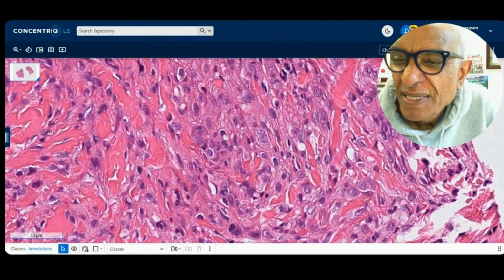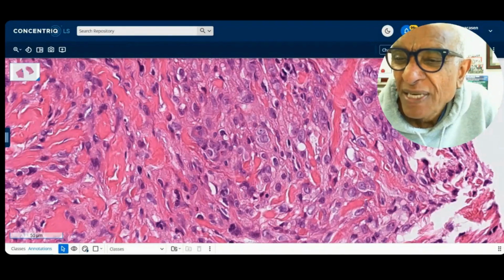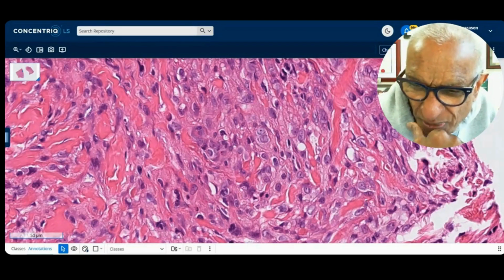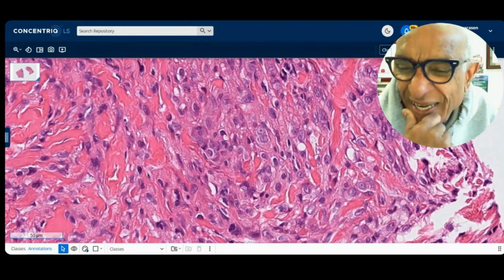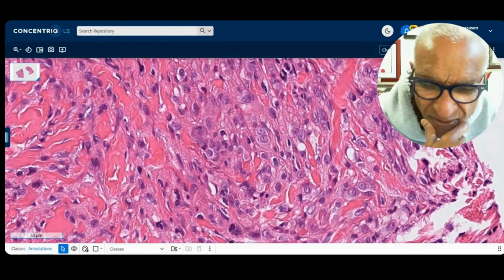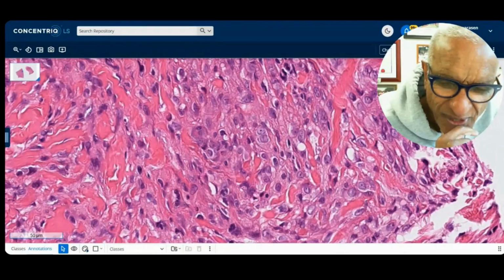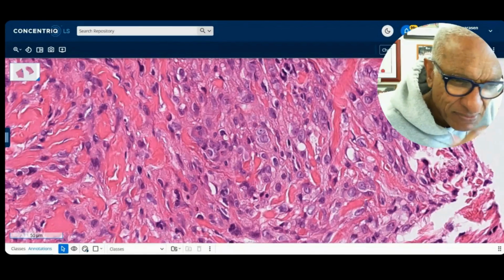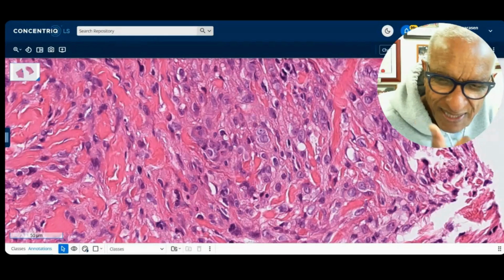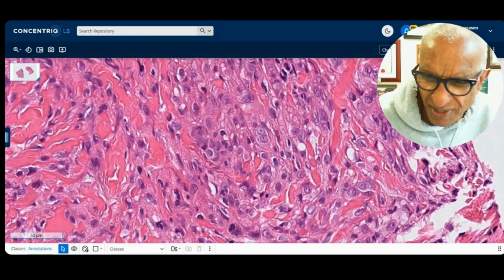No RBCs. Not sure what a bite cell is. You have to explain what that means, Solomon. Bite cell, but epithelioid hemangioendothelioma, rule out myofibroblastoma. So if you thought epithelioid hemangioendothelioma, and if you did do a vascular marker, the CD31 would be negative, but the CD34 is positive. Now I'm giving you the markers because you mentioned vascular. ERG is also positive, okay? And I'm not being surreptitious. I'm just giving it to you as you're requesting it. So you've got CD31 negative, but you've got CD34 positive and ERG positive in this tumor.